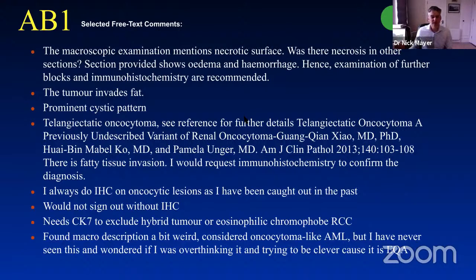Having had a look at this paper, I don't think there's any clinical significance to this. It's just a pattern that you see in oncocytoma. And it's probably analogous to the sort of patterns in CIS, being more relevant to us diagnostically to make the diagnosis rather than it having clinical significance.